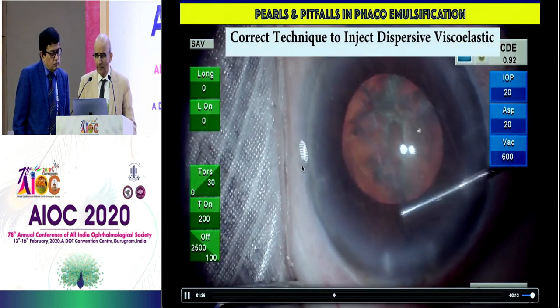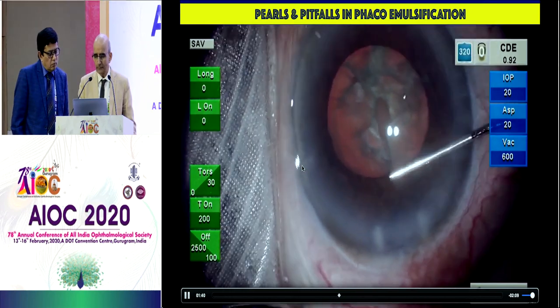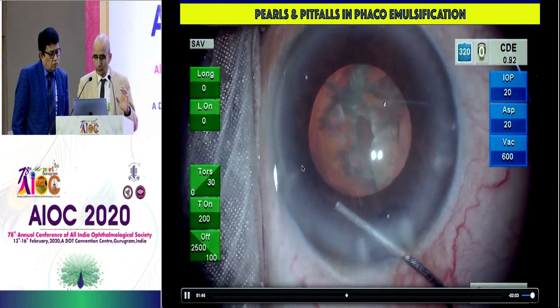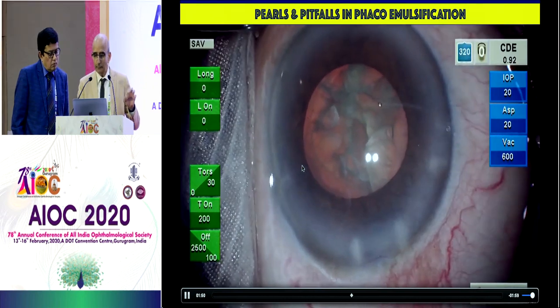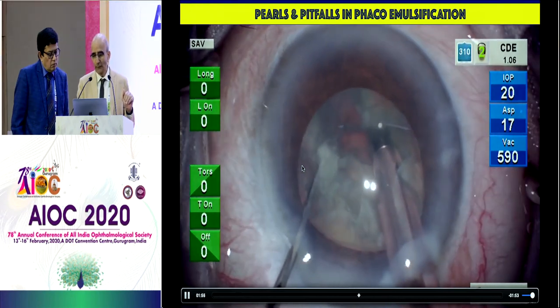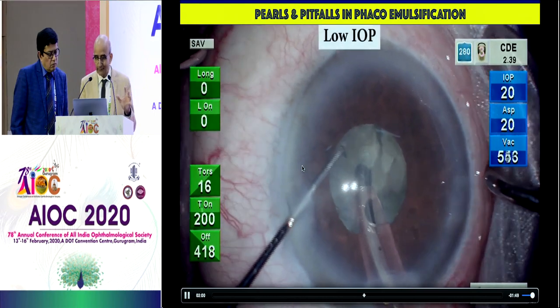This is a fairly familiar situation. The correct way to do it: inject viscoat on top of the iris and stabilize the globe with the other hand. Now things are good. Inject again on the side port, underneath the side port without touching it. The viscoat will do the job and now things are okay. But once again, it can constrict more.